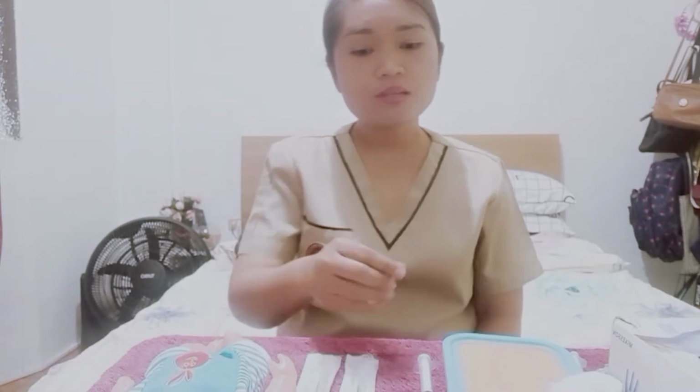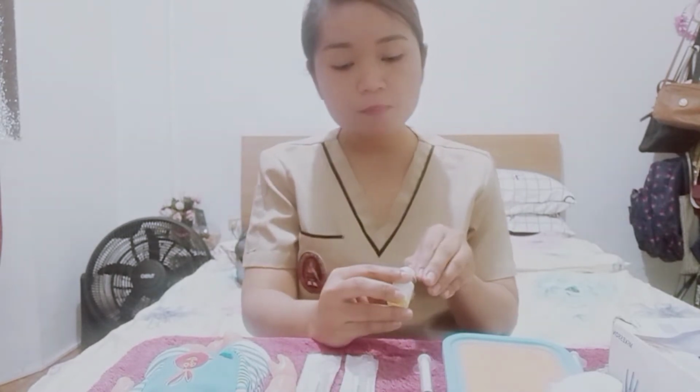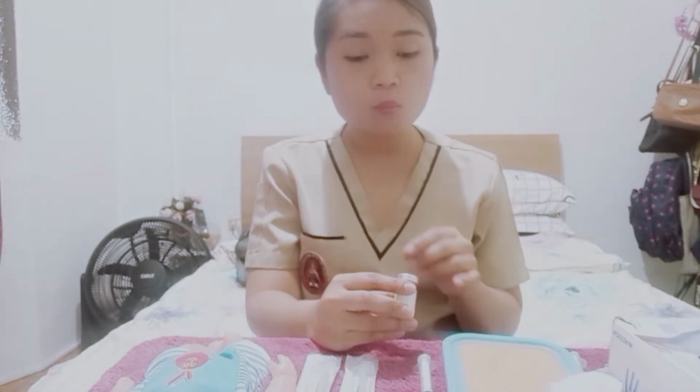Now, for injectable vaccines that do not need reconstitution, so in a vial, all you have to do is just remove the cap. So after removing the cap, we have to make sure that we maintain the sterility of the rubber bung. There's really no need for us to wipe the rubber bung with cotton balls with alcohol, especially if it's a single dose vial, and of course, especially if it's visibly clean.